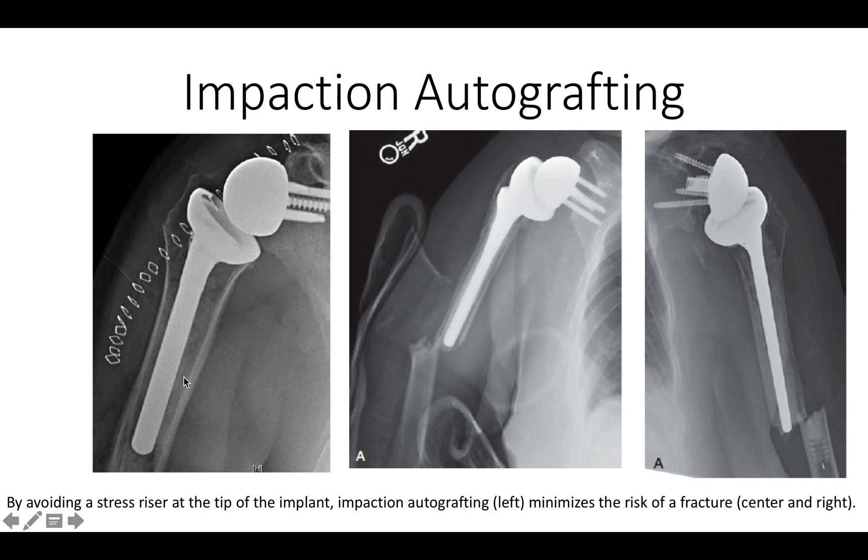The bone graft can be seen as this fluffy cloud placed here and below, so that the load applied by the glenosphere to the humeral component is nicely transmitted from the humeral component to the bone.